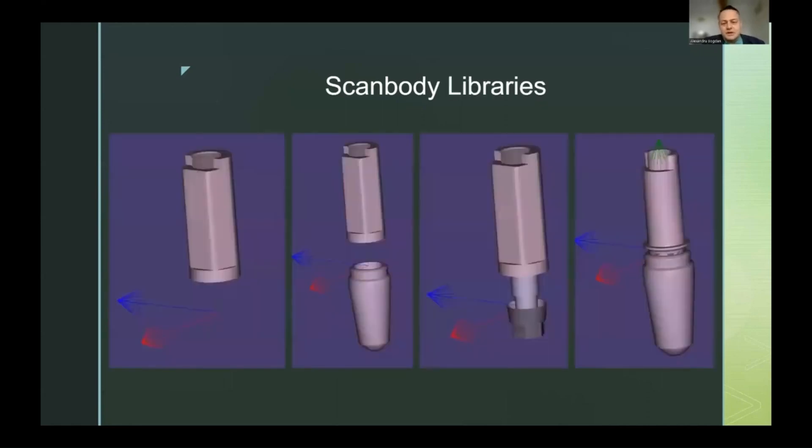The library contains the perfect dimensions of the scanbody, and correlated to it we have a virtual implant, the implant's hex, and various other connections that will be used for the final work — like hybrids, direct-to-implant connections, or multi-unit connections. So the scanbody transmits to the lab the implant's position, angulation, hex placement, and any other connection structure. Every piece of information needed to build the final work is contained in this library.